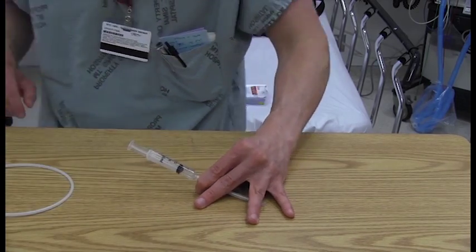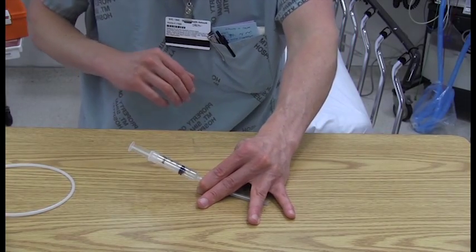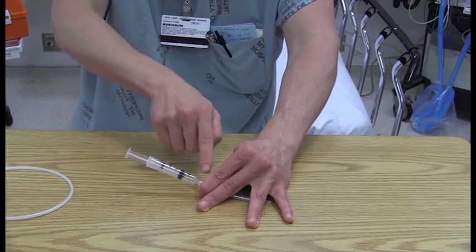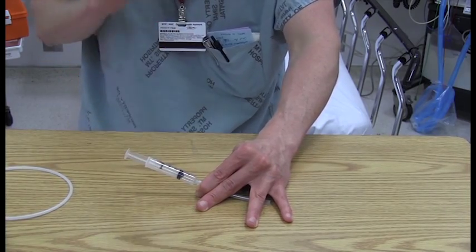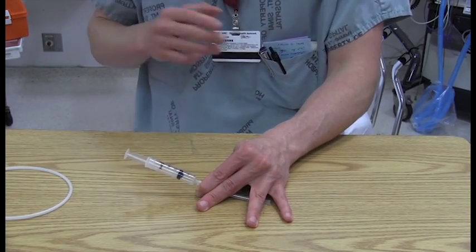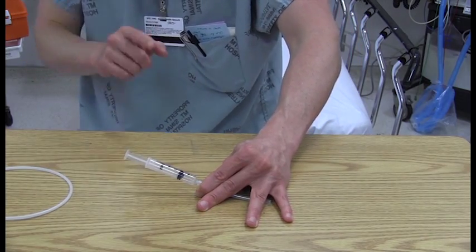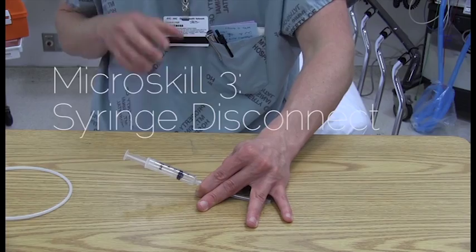Now, when you do this properly, what you should be able to do is actually smack your hand, move the table, and the needle hub does not move. That's how you know you've gotten this to the point where the micro skill is complete. Now, the next step is actually disengaging the syringe from the hub of the needle without moving it.